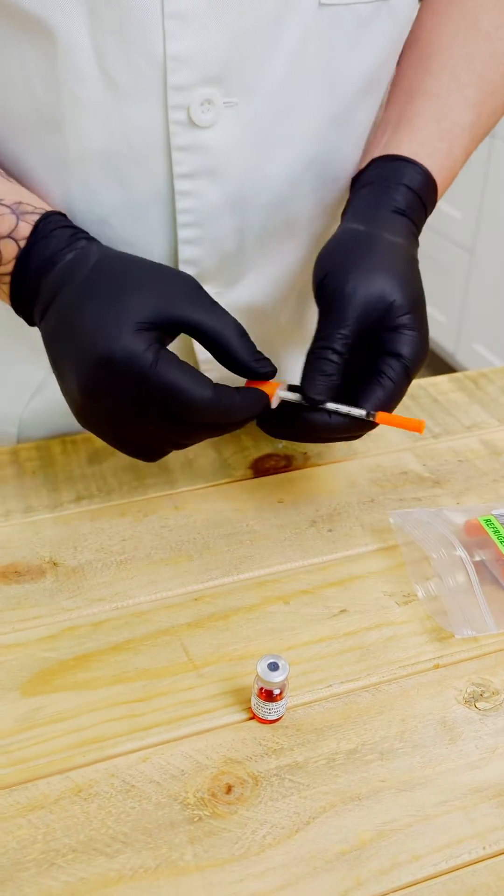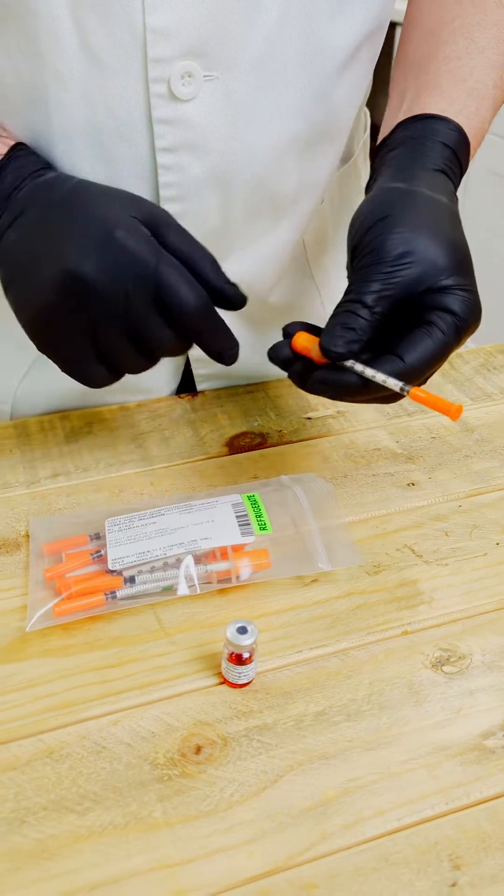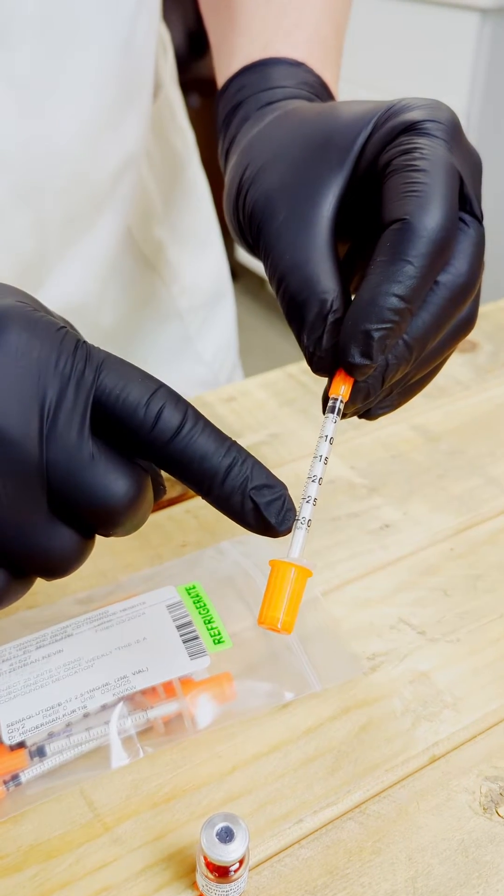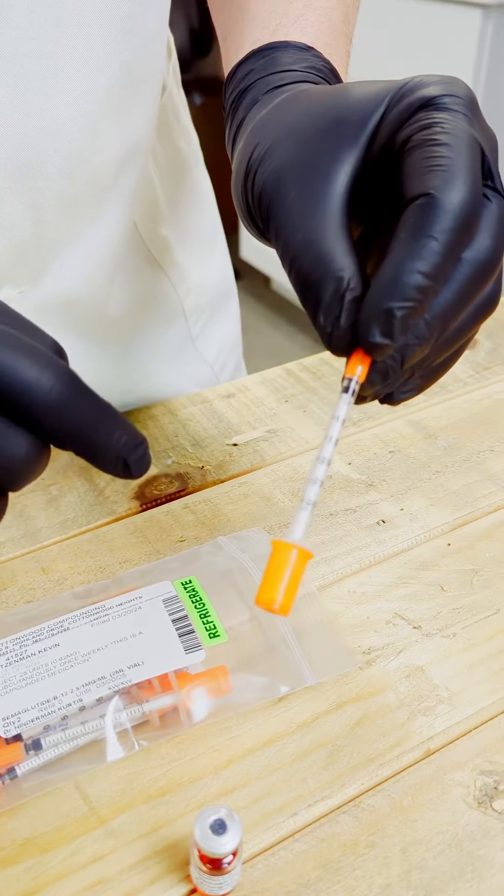Next what we want to do is, as you remember, on the prescription itself it says we were injecting 25 units. On the syringe we have a 30 unit syringe. They come in 30 unit, 50 unit, and 100 unit.